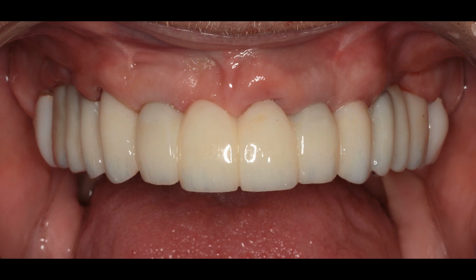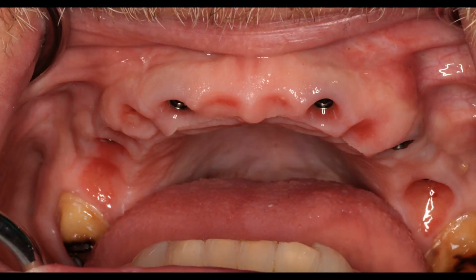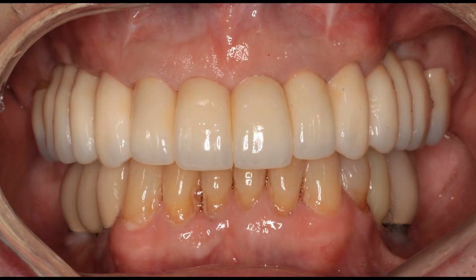You'll notice the soft tissues haven't changed at all. Picture of the soft tissue development. His final restorations, and again, practically no change to the tissues at all. Some of that has to do with what we call biotype, the thickness of the bone and the gum tissues that you were born with. The better the biotype, the more results like this we get. The more delicate the biotype, we still get results like this, but it's a little trickier and requires a little bit more finesse.